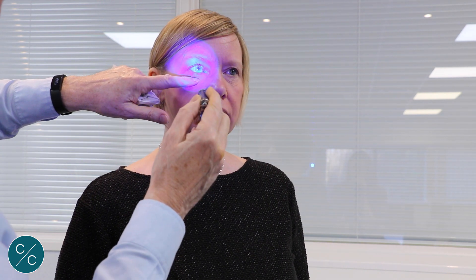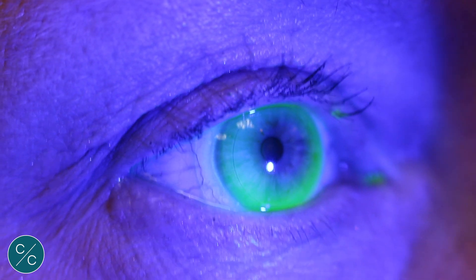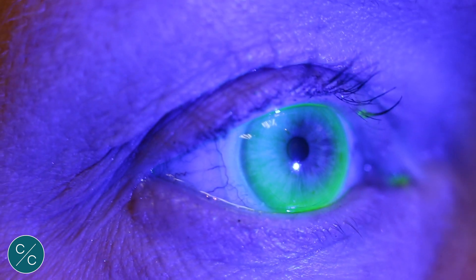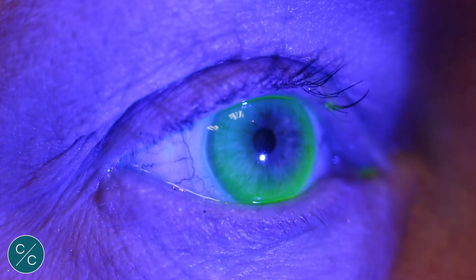Okay, the first check that we'll make is to have an overview of the lens to make sure there's no air bubbles and to have an assessment of the fit. So we'll take a UV light like so and shine here. Now we can see whilst there's no bubbles present, we can actually see there's very little central clearance over the centre of the lens. So in this case the lens is probably too flat and we're going to select another lens which is slightly steeper.